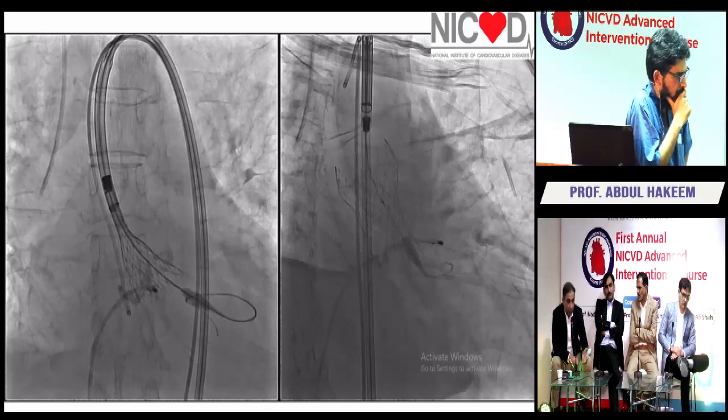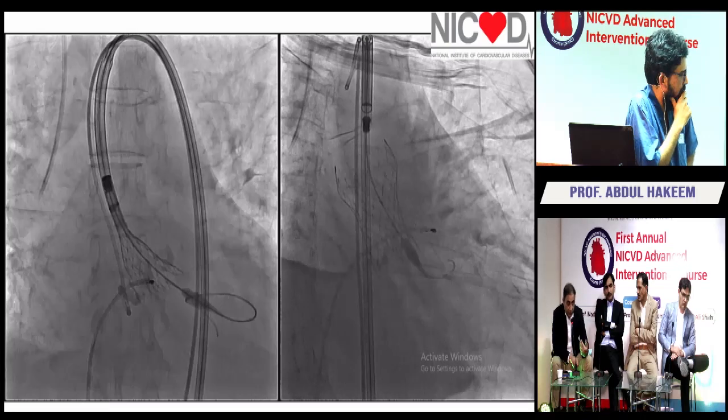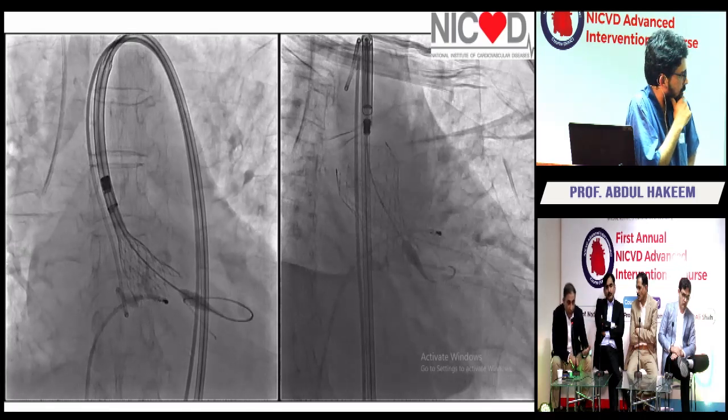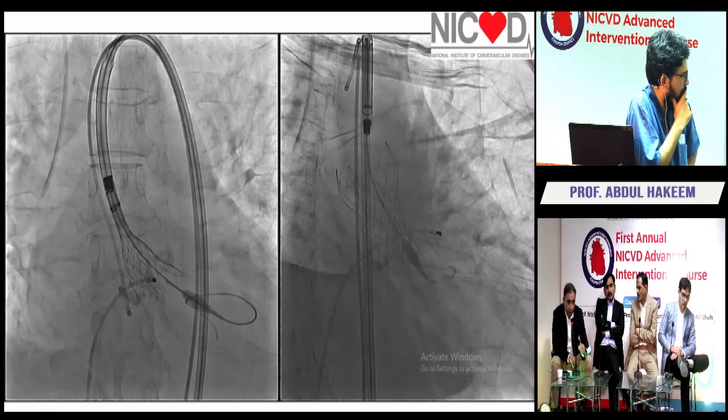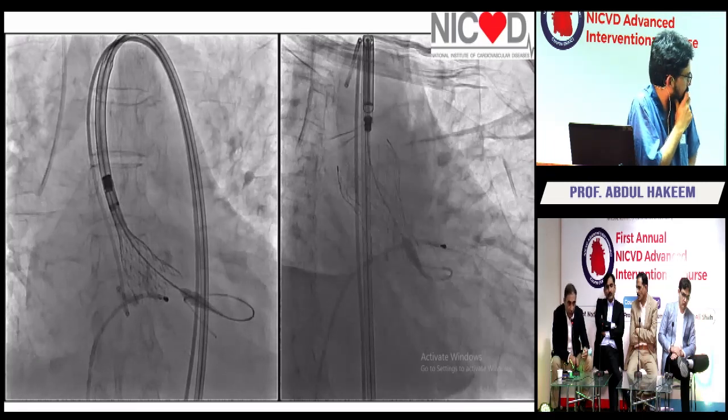So compared to the coplanar view, in patients who have a highly calcified valve, those who have calcium in the LVOT, if you go to the cusp overlap view, the chances of blocks in such patients will be low.